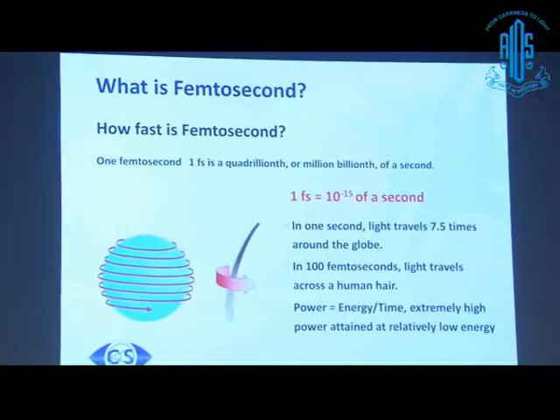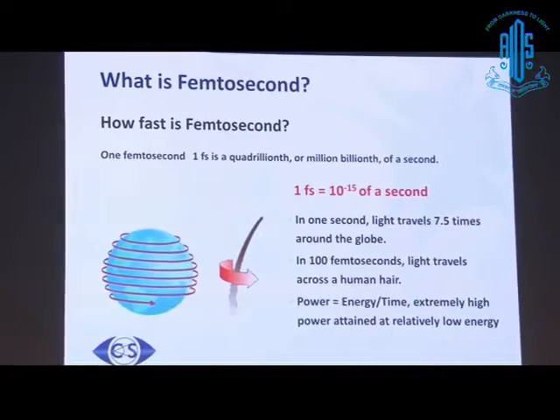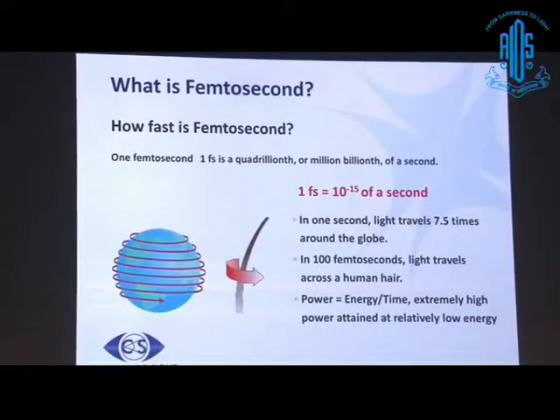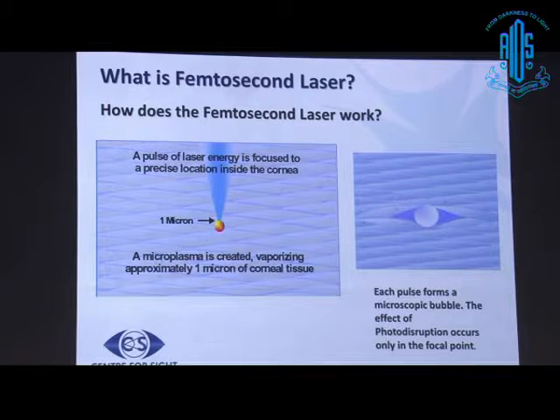Now, the femtosecond laser is a unique cutting tool because it is able to cut without causing much tissue damage in the surrounding tissues. That is because it delivers energy in very tiny quantums of time, which is 10 raised to the power minus 15, or a femtosecond. When you're delivering energy over a short period of time, you basically need less energy, because the energy is delivered in very small areas in a very short amount of time. Therefore, with a lower amount of energy, you're able to produce photodisruption.